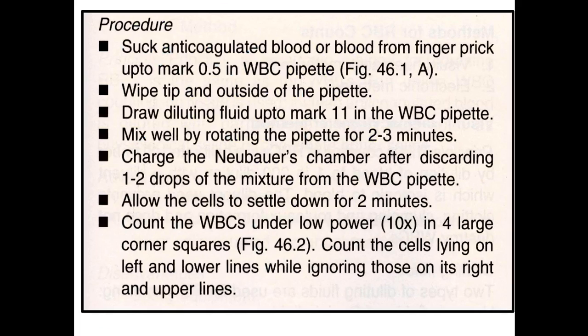And then you need to transfer the mixture onto the counting chamber. This is called charging the Neubauer chamber. Charge the Neubauer chamber after discarding the first 1 to 2 drops of the mixture from the WBC pipette, and then allow the cells to settle down for 2 minutes.